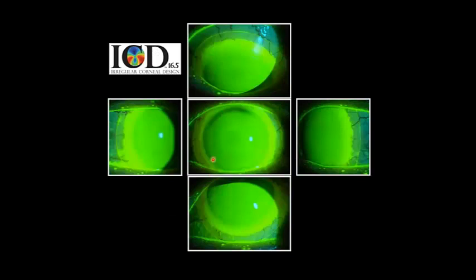And again, if you see this thinning, have the patient look in the opposite direction to that bearing. If it clears, probably not something you need to worry about. If you are concerned, have the patient wear the lens longer, like 2, 3, even 4 hours or more. The longer the patient wears the lens, the more it will sink. The more it sinks, the clearer the picture you'll have, whether it's actually going to touch or not. So what we do is have our patients wear the lenses for 4 hours, if at all possible.